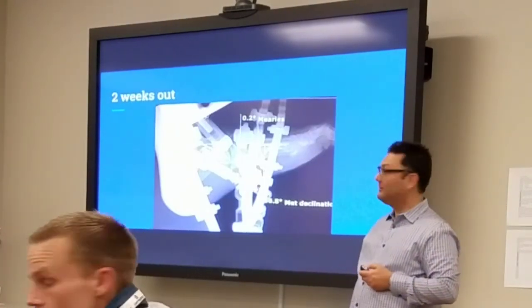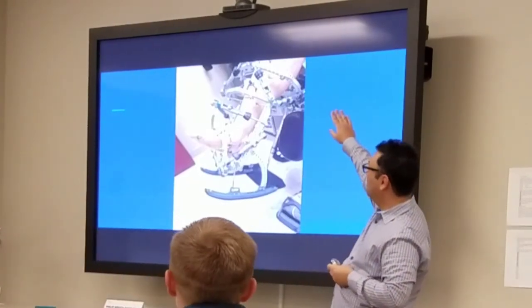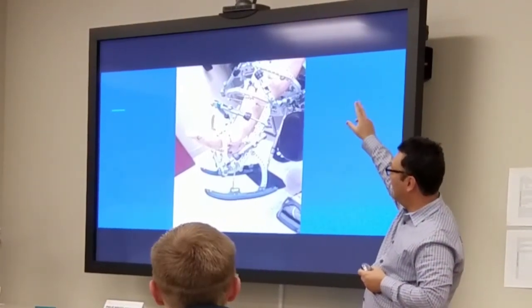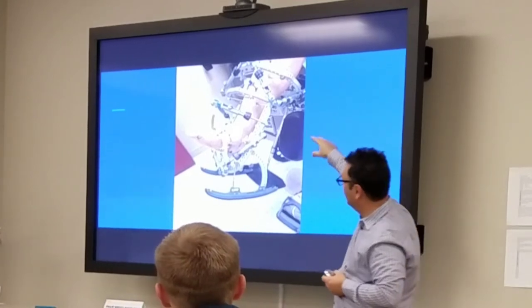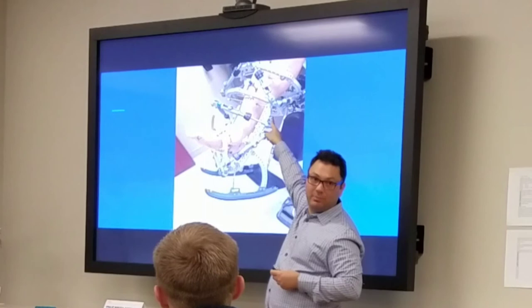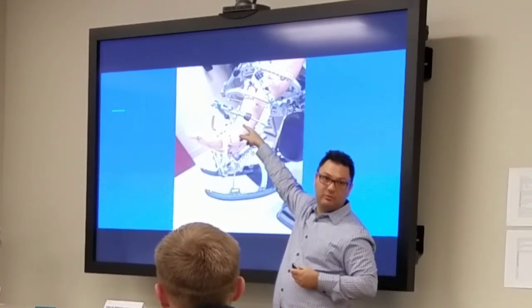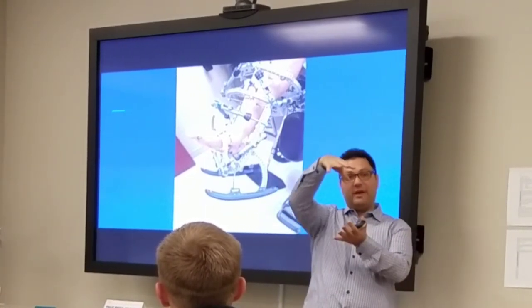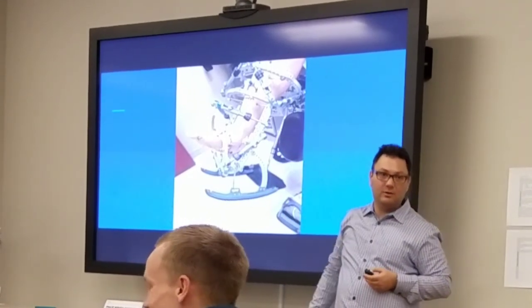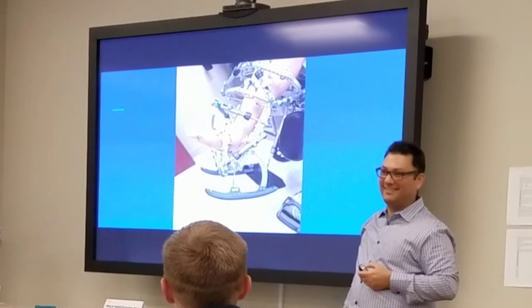Are you running the proximal program to correct equinus? There's no proximal program then. I doubled it up, but her calf got really fat right above that one, and I couldn't get two of the same size. If you notice my other ones, they're stacked on top of each other, two of the same size with 5-hole posts. I'm telling you, it's a sales rep friendly frame.